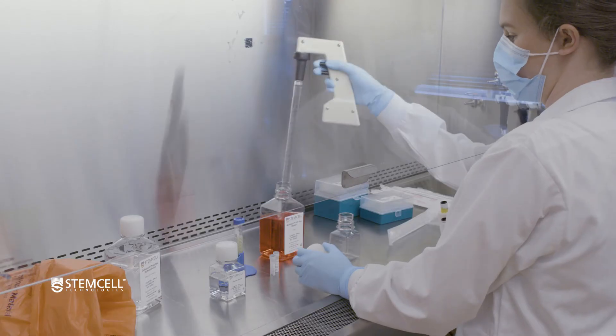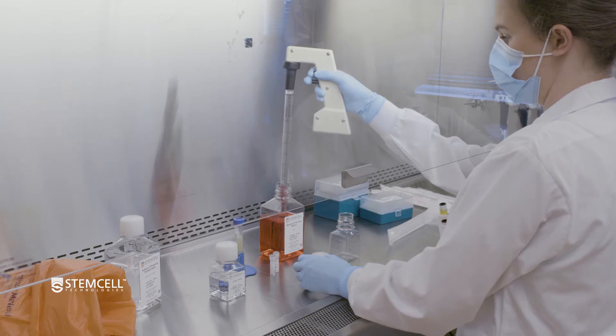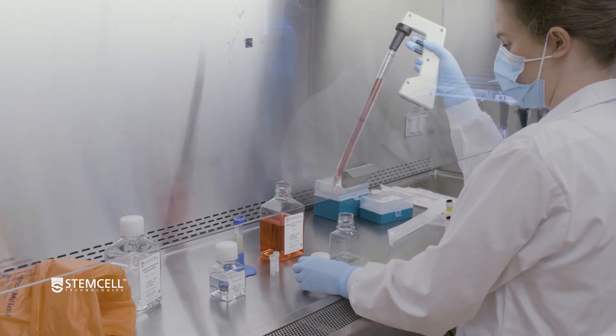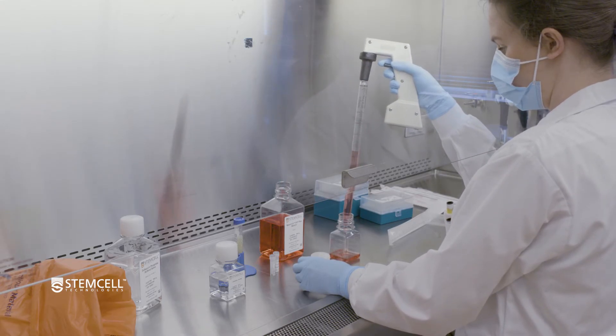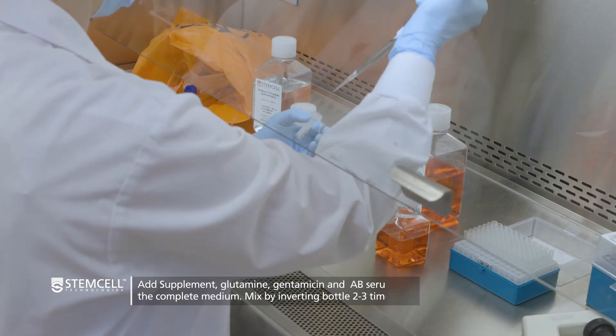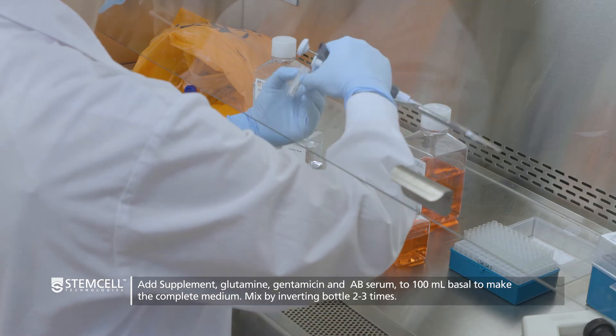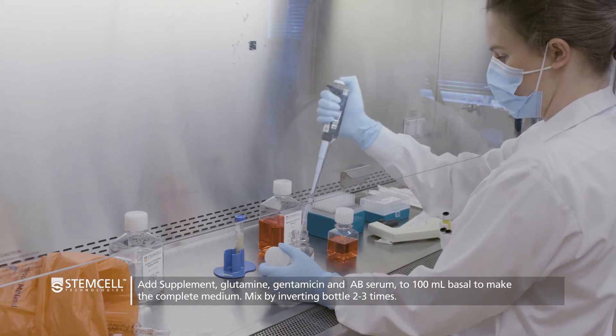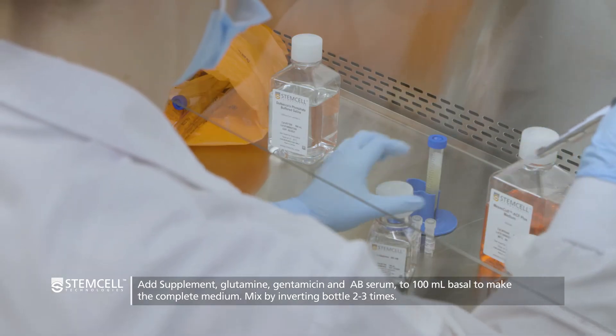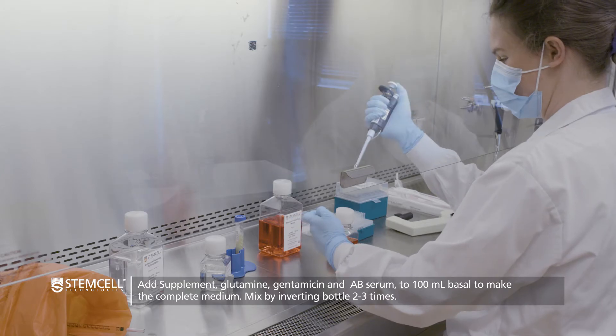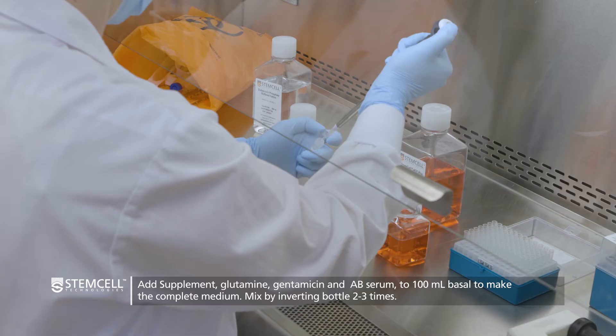To make 100 mls of complete medium, add 96.2 milliliters of MesenCult ACF Plus Medium, 200 microliters of MesenCult Umbilical Cord Derivation Supplement, 1 milliliter of L-Glutamine, and 100 microliters of 50 milligrams per milliliter Gentamicin.